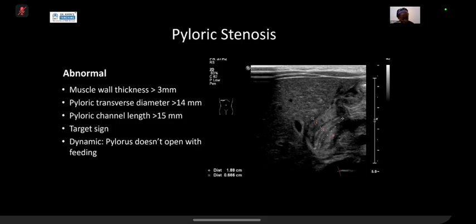Is that what you're saying? I'm not sure. It's the measurement from one wall across the middle and then across to the end. And yeah, sorry, I think that is a typo. It should be less than 7 rather than 14. Oh no, each wall is 3 millimeters. I'll come to you at the end because I think I'm interrupting what I'm saying by answering your questions. And I'll double check the measurements to see if we've put a typo in.